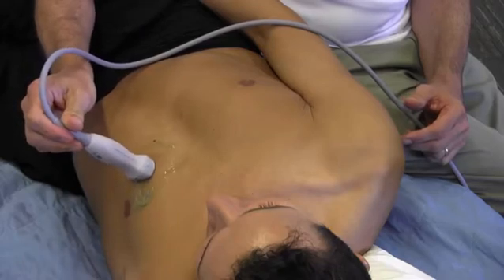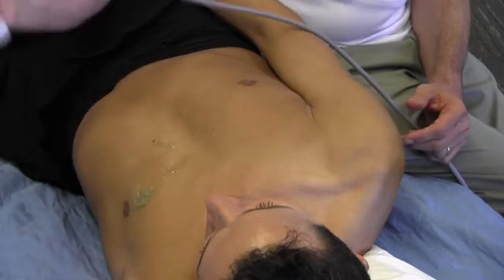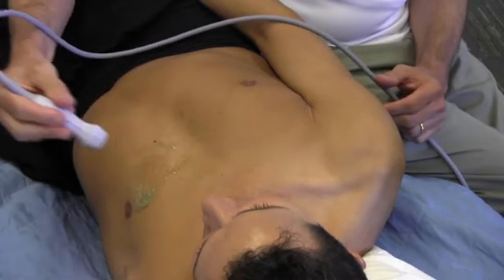Here we have it held incorrectly, well away from the stabilization point of the probe. Here we have it held like a dagger. Here we have it held with a pencil hold, but without the hand on the chest wall.